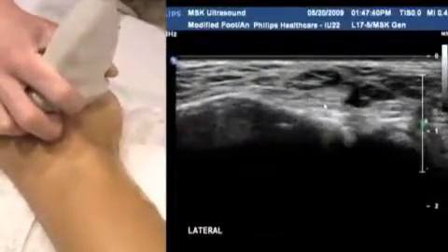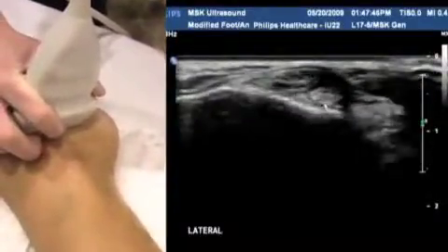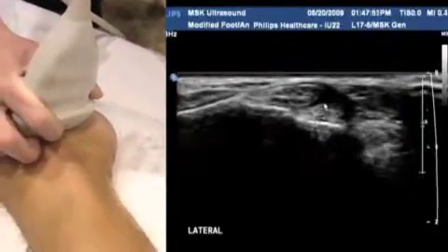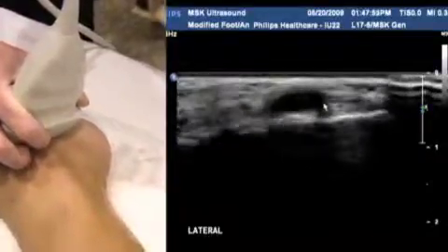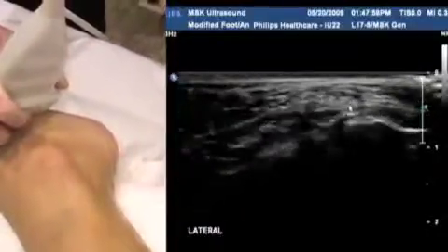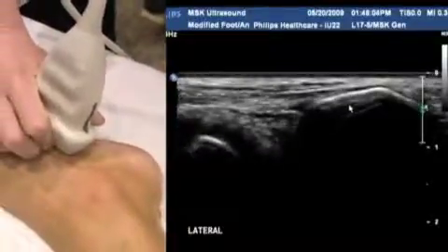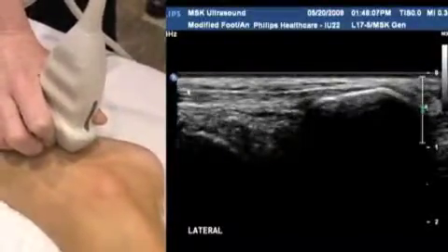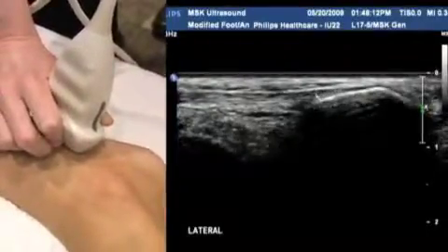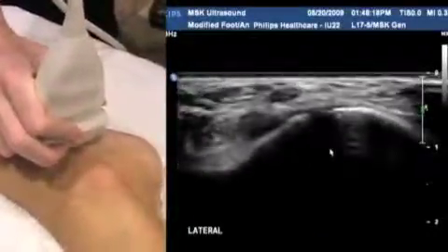You can see they stay paired as they head down the ankle, and they start to branch off just distal to that malleolus. And at this point, you're going to have to make a decision as to which one you're going to study first. So let's go with brevis, this guy. Following it all the way down until it attaches onto the metatarsal. Again, just looking at that distally in sagittal, coming all the way down from proximal, expanding out and attaching onto the metatarsal. That's peroneus brevis. Which metatarsal is this? The fifth metatarsal.